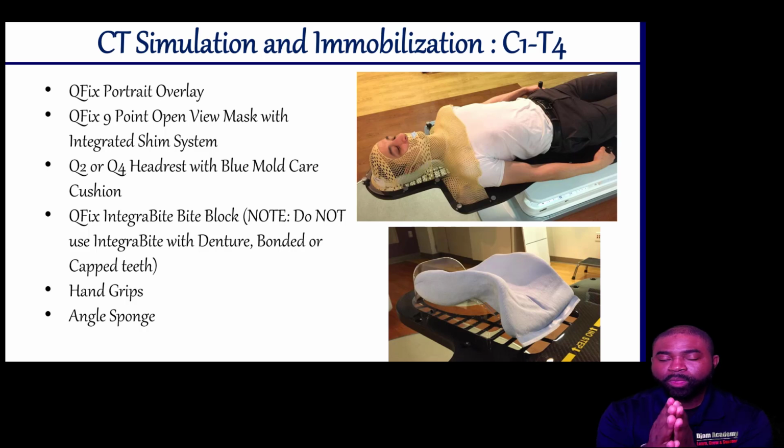And for C-spine cases, in our clinic, we use the Q-Fix overlay board. We have the 9-point thermoplastic mask, sometimes with the use of shims. We have a headrest.